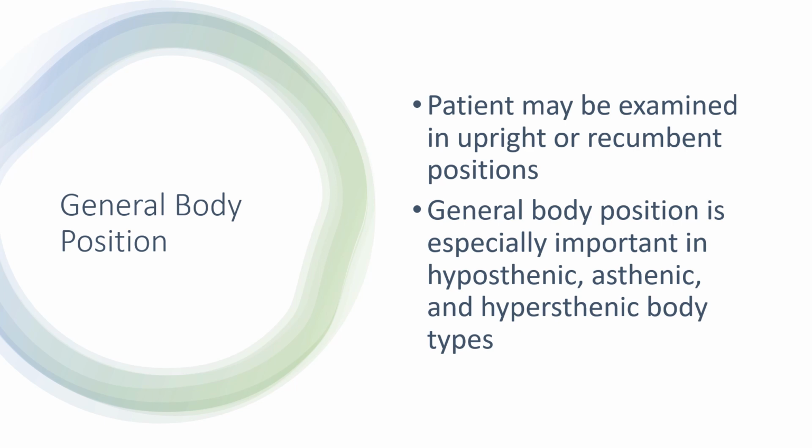General body position. You can do these standing or laying down, depending upon your patient. Again, assess your patient. If your patient is well enough to stand up or sit upright, you might find that it's actually easier to do the skull exam upright than it is supine. However, if your patient has other injuries and or is not able to bear weight on their legs, you might find it wiser to lay them on the exam table for these projections.